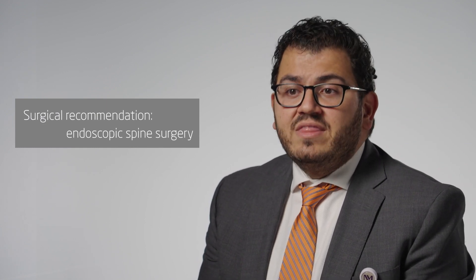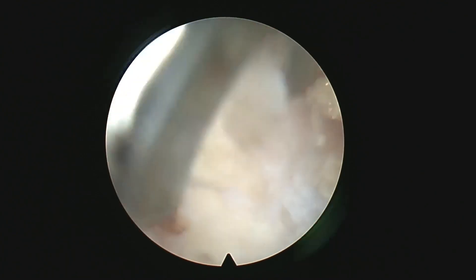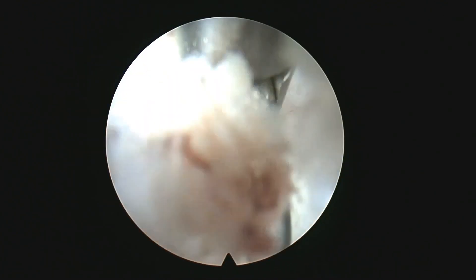In a way, we're able to get in there, get the disc out, without disrupting the normal tissue around the spine. What you're seeing here is the translaminar approach. We're going down with the endoscope, and now we're docked at the ligamentum flavum.